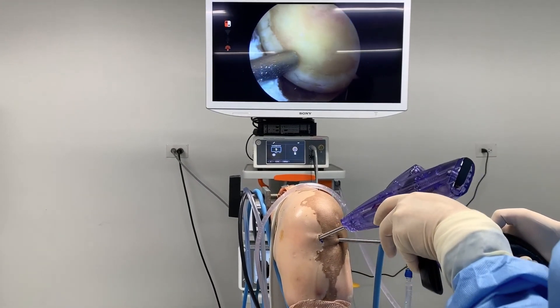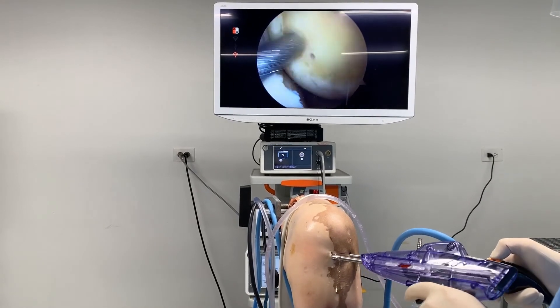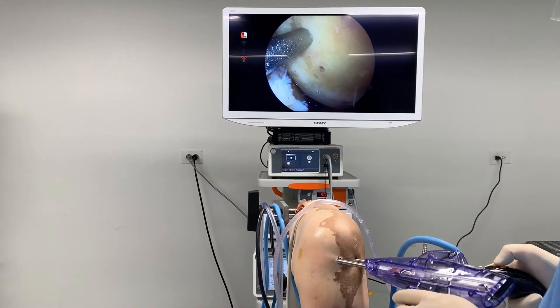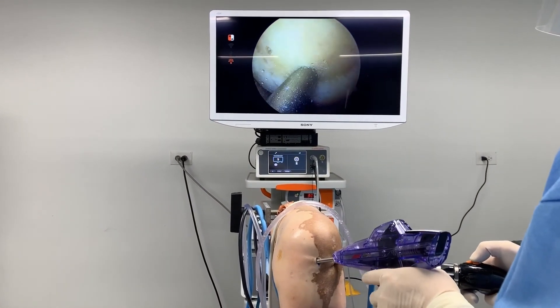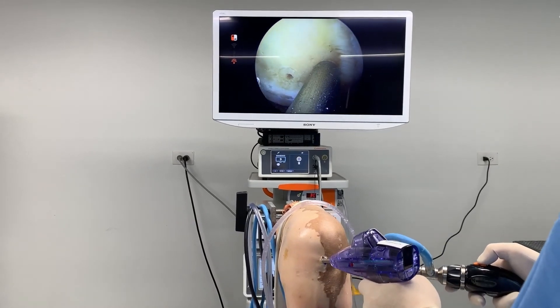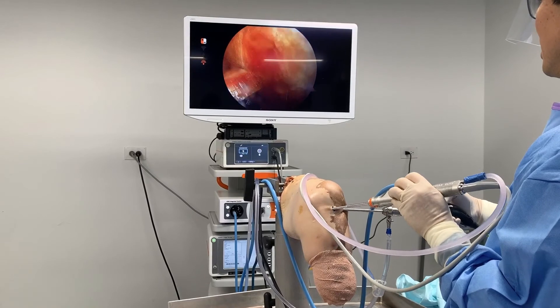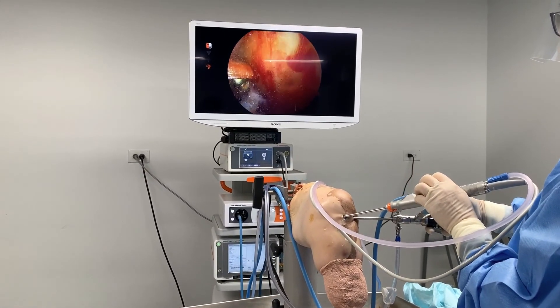Dr. Koh is operating the SmartShot device with his left hand while he maintains full control of the arthroscope with his right. He easily places precise marrow stimulation holes and uses the SmartShot lever mechanism to smoothly remove the needle from bone and simultaneously recharge for the next shot. He finishes by applying suction and observing marrow and blood flow from each of the channels.